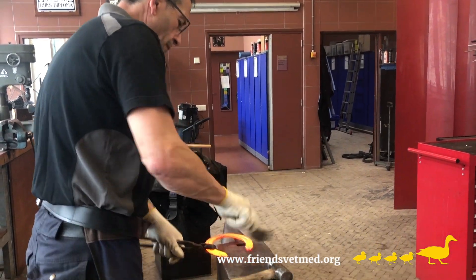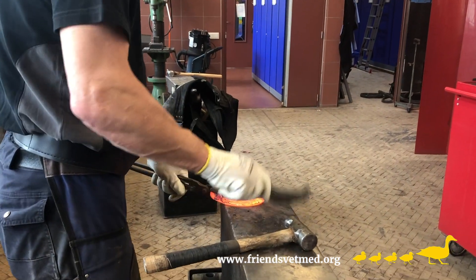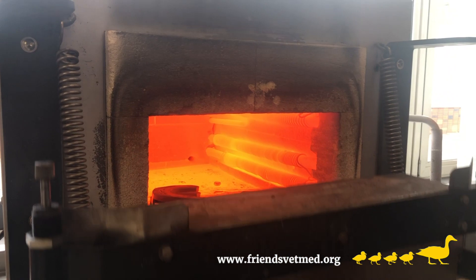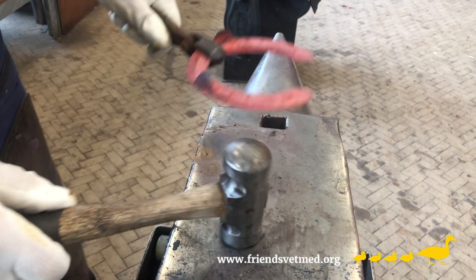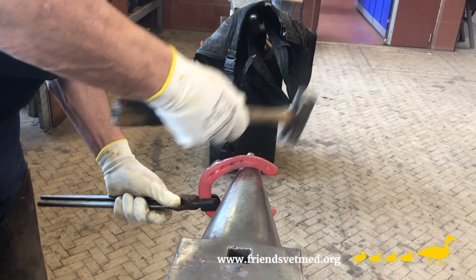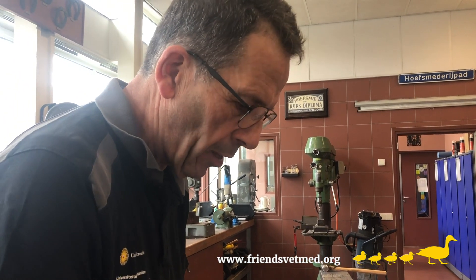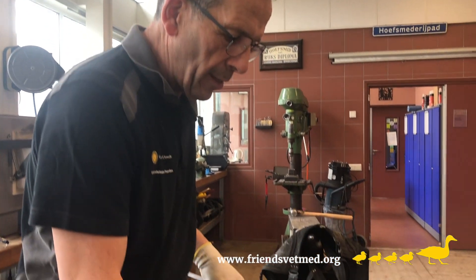Horseshoes have been fashioned in the same manner for centuries. First, they're heated in a forge and once they're soft enough they're shaped with a hammer. That way of doing things works up to a level, but there are downsides.